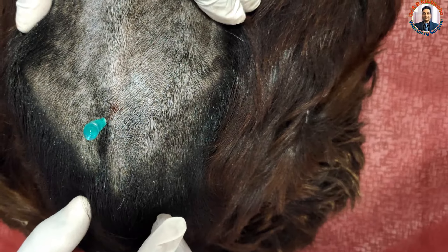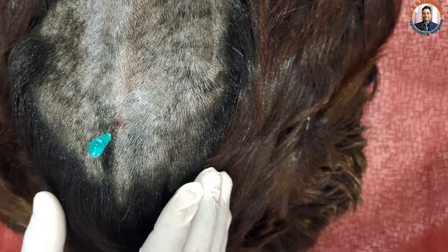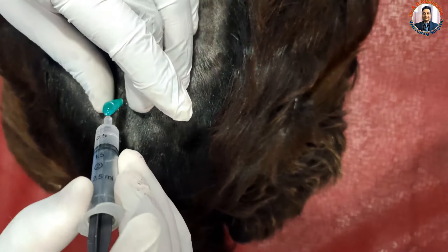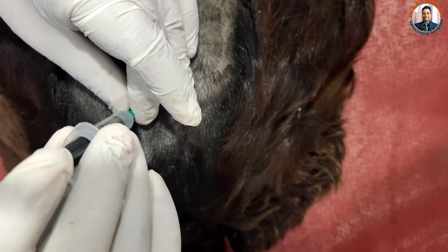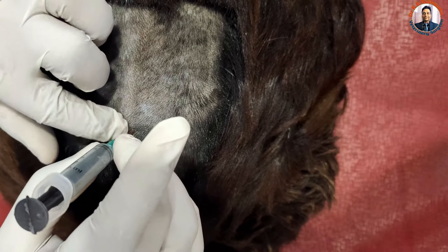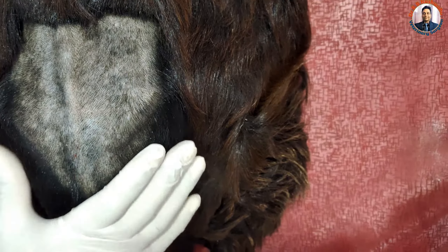The oozing of CSF is an indication that the needle is in the subarachnoid space. Since CSF is coming, I will now administer 1 ml of 2% lignocaine hydrochloride local anesthetic, and then gently remove the needle.